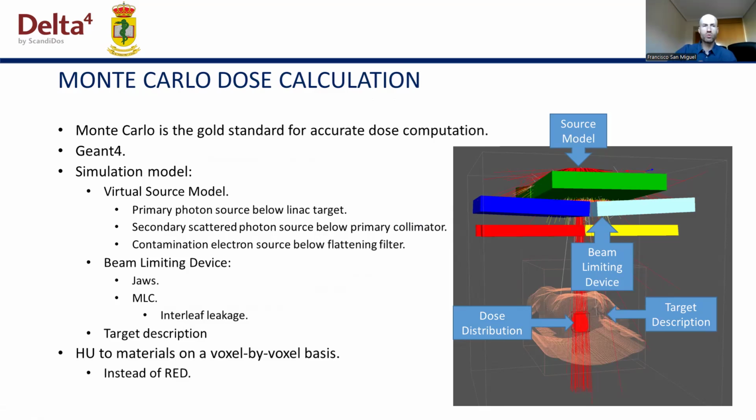In order to obtain the dose on the target, in contrast to some other photon Monte Carlo algorithms, the Insight algorithm relies on specific material definitions to model the patient, as opposed to a simplified electron density-based patient model.